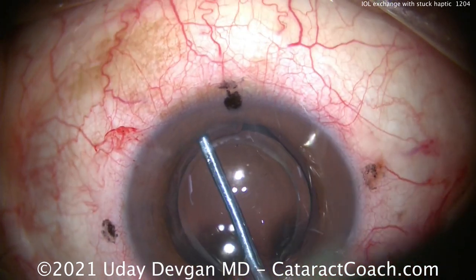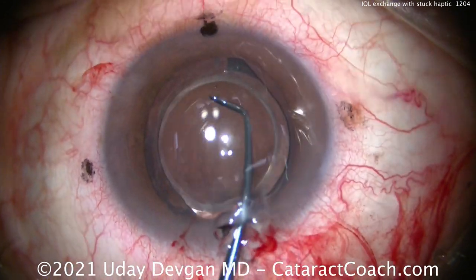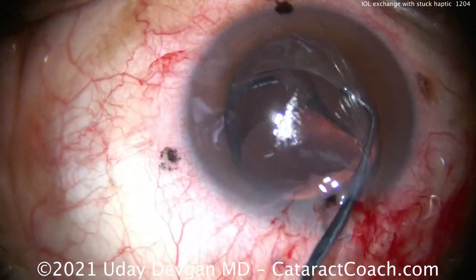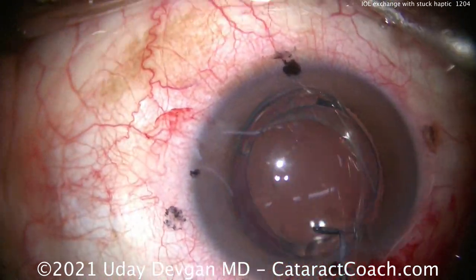Remember, this lens is the Alcon Panoptix. It has a bulbous tip on the end of the haptic, so you really have to do a full dissection with that blunt spatula to free it up. And there you can see that haptic is completely freed up. That looks great.